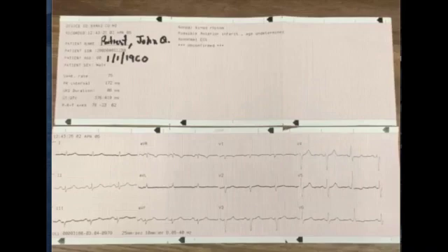Are all leads visible? If these questions cannot be answered with a yes, then please reacquire the ECG and/or retake the photograph as needed. Do not send illegible, blurry, or incomplete data to the doctor. If you cannot read it, then they cannot read it.